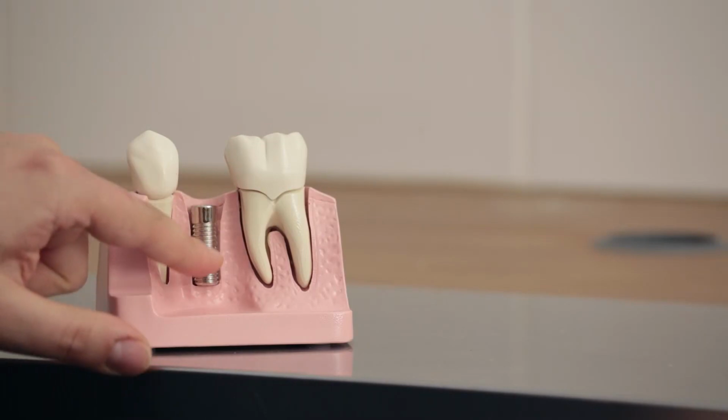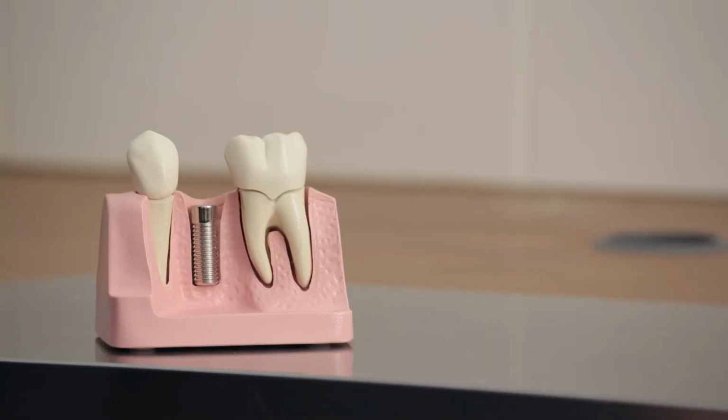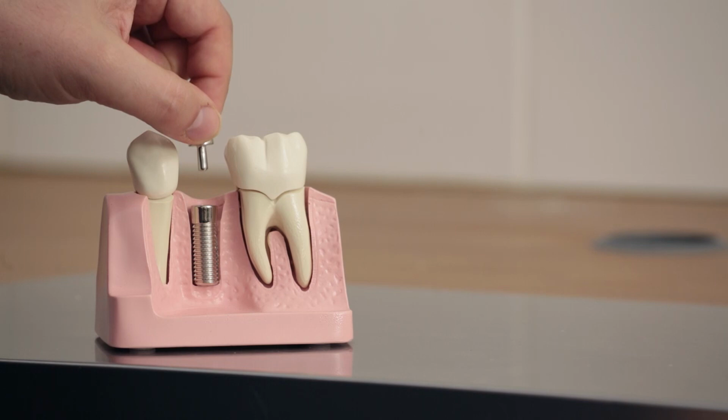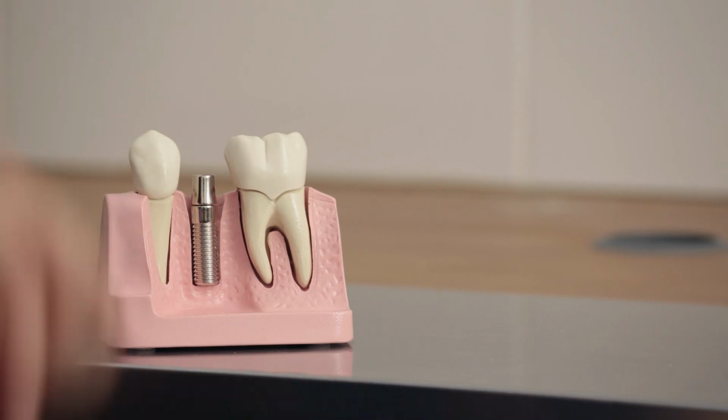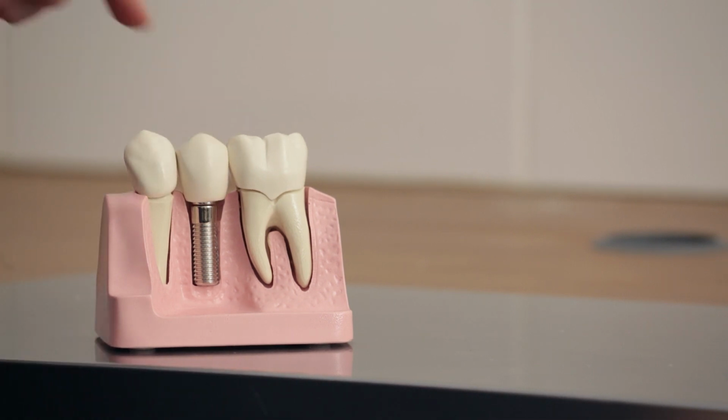The implant is placed into the jawbone, and it needs about a 3 to 4 month healing period. During that time, the bone fuses with the implant surface, and the implant becomes embedded and integrated with the jawbone. After about 3 to 4 months, you will return to the dentist, and the dentist will place what's called an abutment on the implant. This abutment will eventually be a supporting post for a replacement tooth.